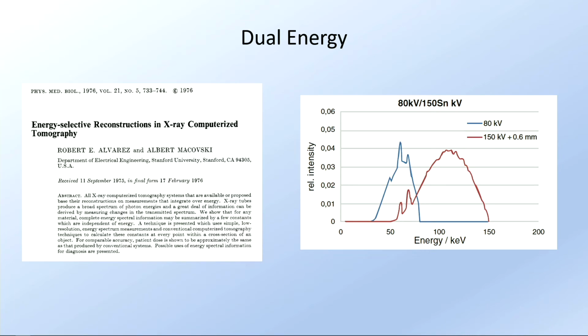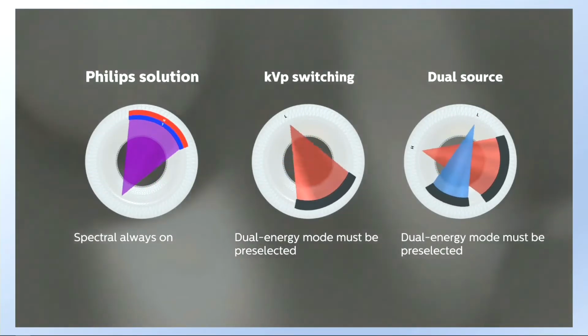But today we're talking mostly about spectral CT. So spectral CT is not new. It comes from the 70s, when the initial work showed that you could use the data from different energies of photons to add value to your studies. And this can be done in different ways.